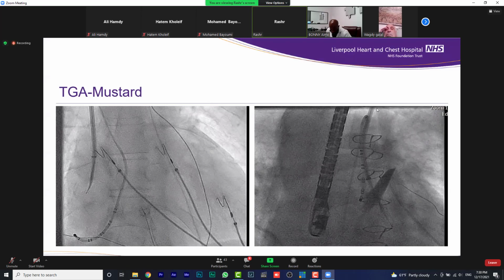So we came from the left internal jugular. You can see a coronary sinus from the left IVC through the hemiazygous continuation and back into a left SVC. So from the left jugular, I've again perforated through the baffle back into the atrial mass, which I don't think I would have got into in any other way.